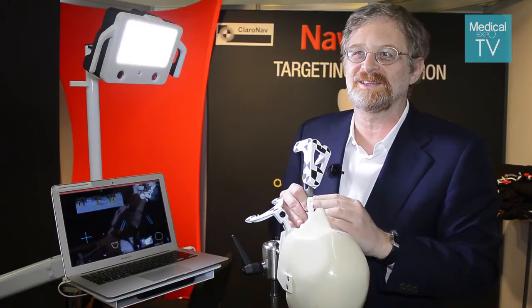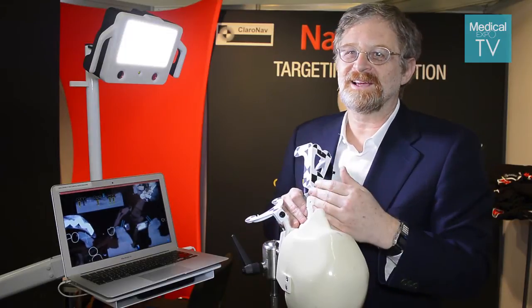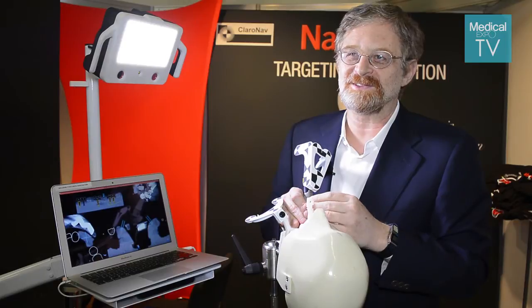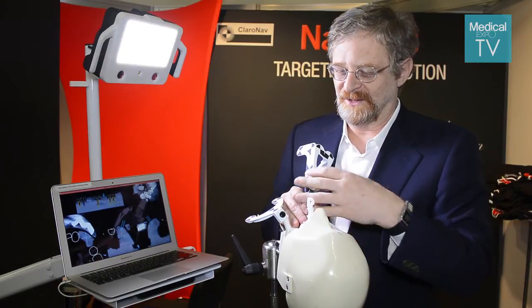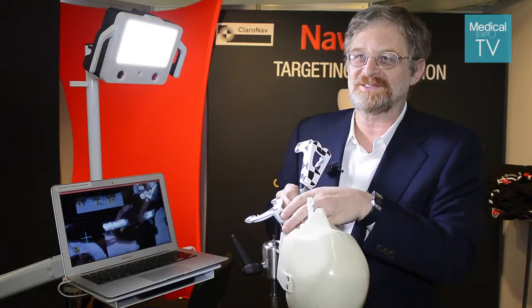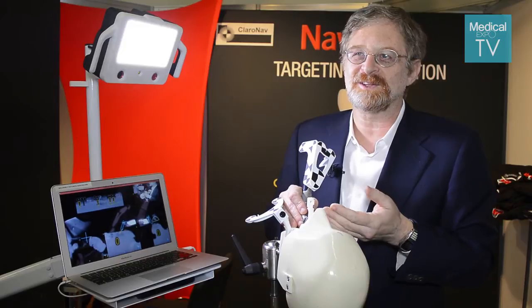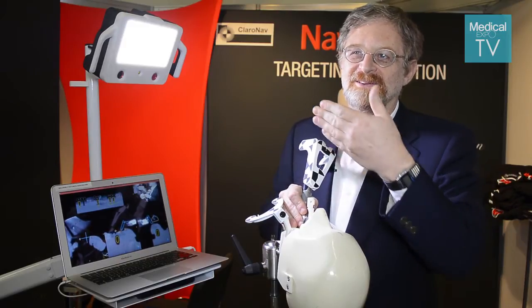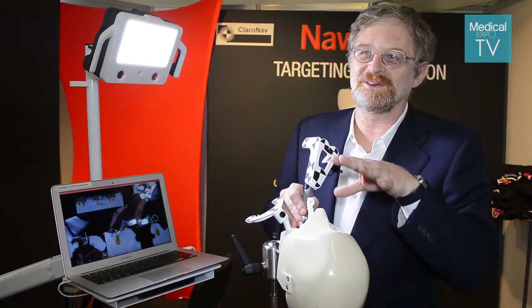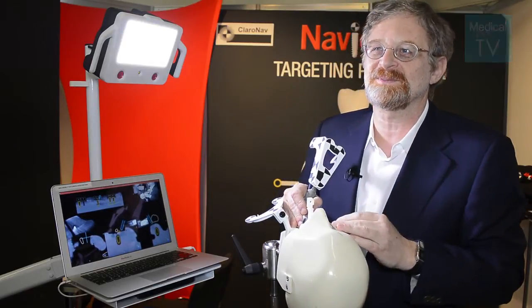They can just look at the screen and drill one hole after the other much faster than otherwise. We offer the system, including the training and the planning software, for $20,000. They also buy a kit per procedure which includes the plastic tags and the stand they put in the mouth. We sell those for $59 per implant they place — so if they place one implant they pay $59, if they place two they pay twice as much, and so on.